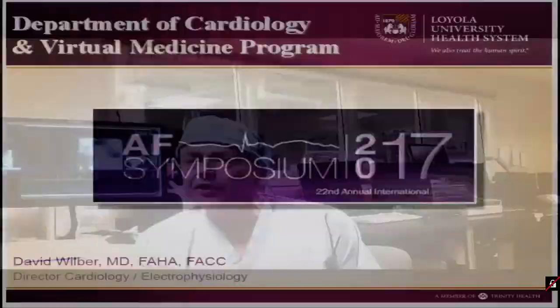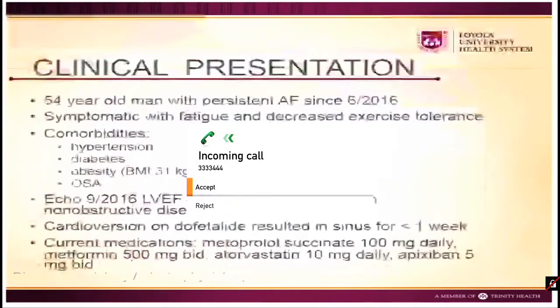Today we're doing a case of persistent atrial fibrillation and demonstrating our approach with rotor mapping. I want to briefly give you some notes on the case. You can show the next slide.